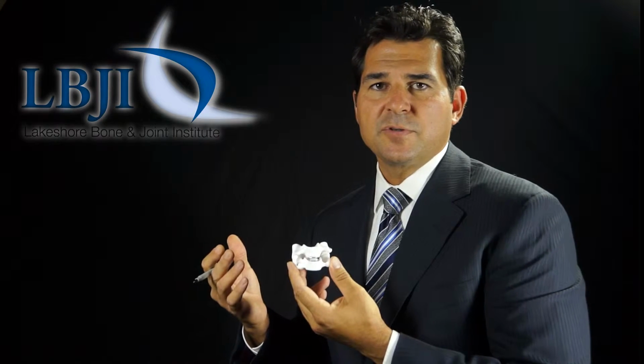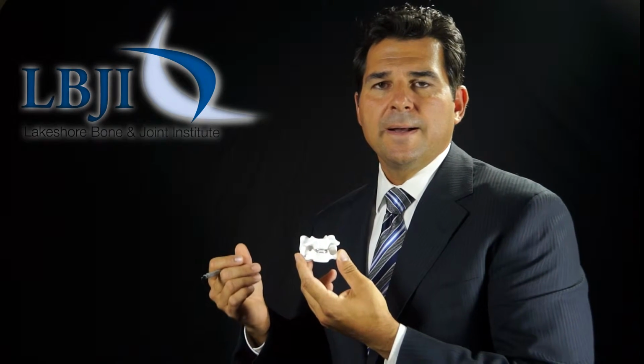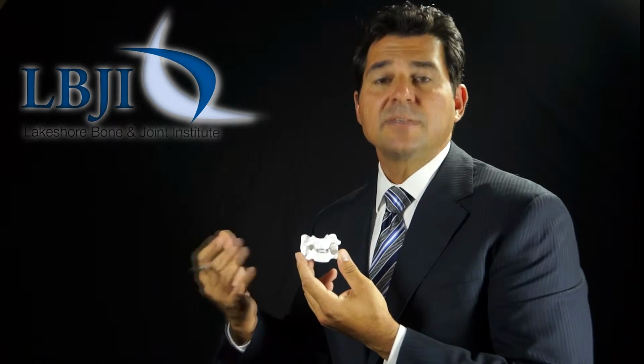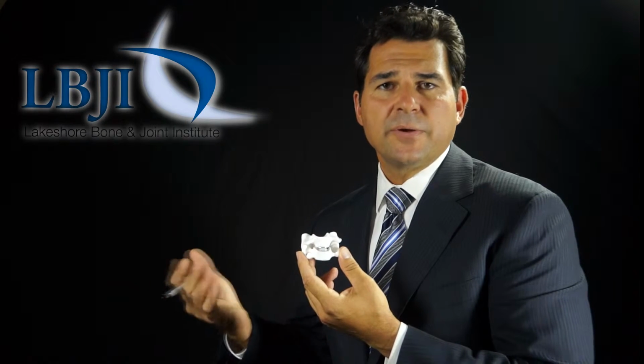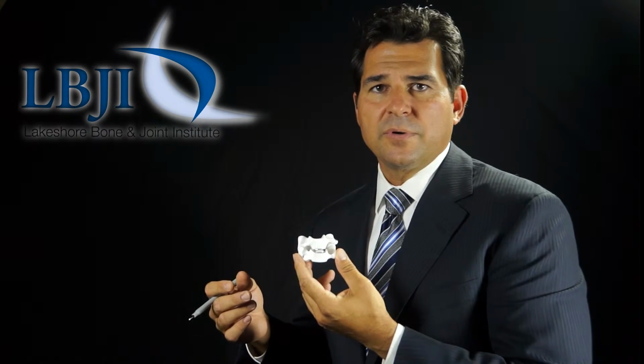Additional benefits of an artificial disc surgery compared to a fusion are patients are able to get back to work sooner. They don't have to wait with a collar for 6 weeks and have that stiffness and achiness from the collar that usually requires physical therapy to get them moving again. With an artificial disc, usually 2 weeks after surgery, we can get them back to sedentary duties or light duties such as office type work without too much discomfort or difficulty.